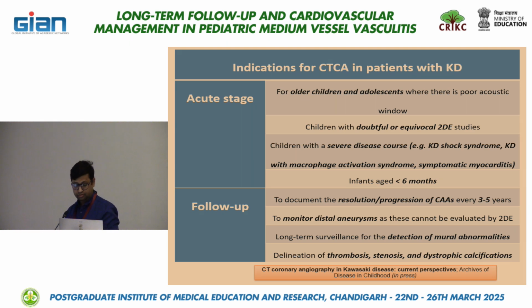Aneurysm follow-up to document the resolution of aneurysms, to monitor those that cannot be evaluated by echo, long-term surveillance for abnormalities, and delineation of stenosis and dystrophic calcification. Thank you.